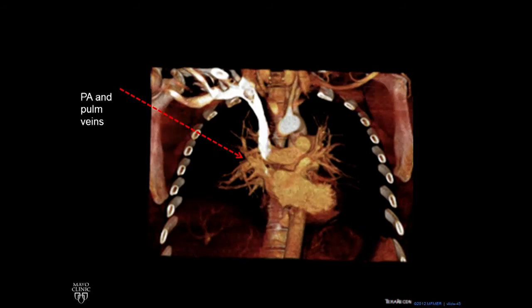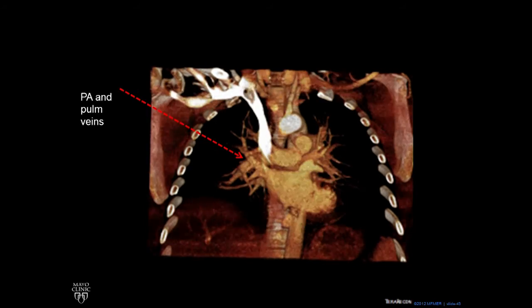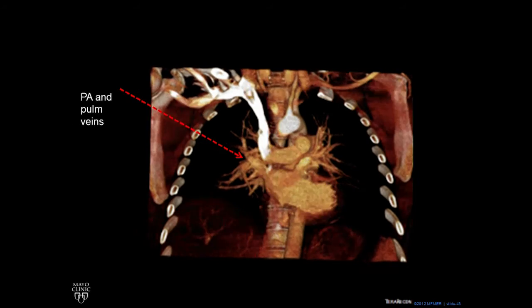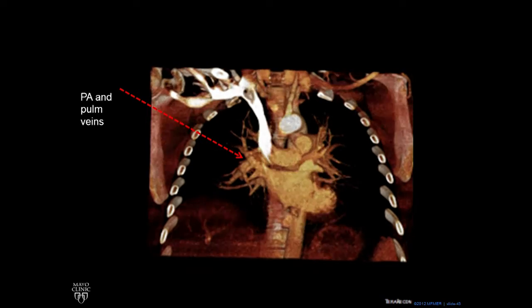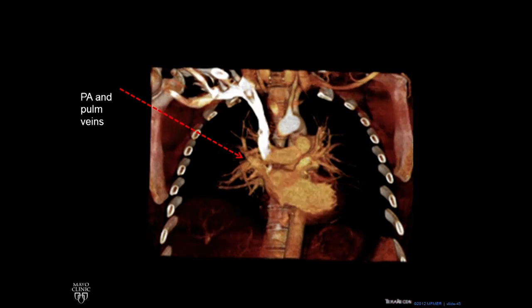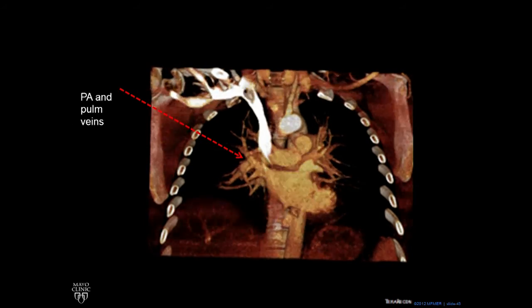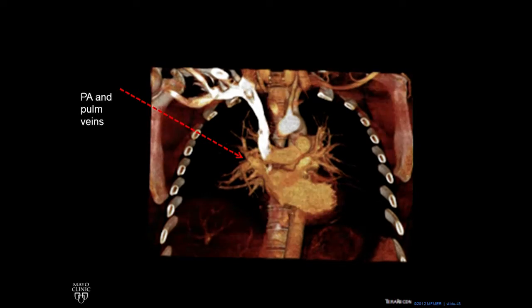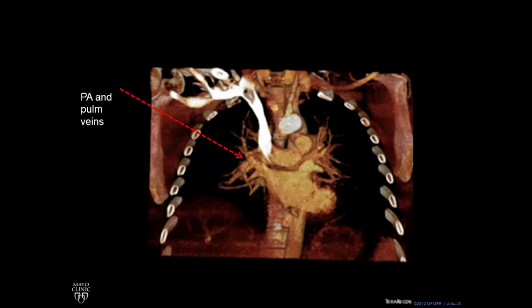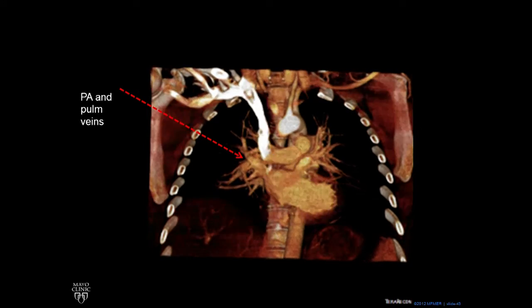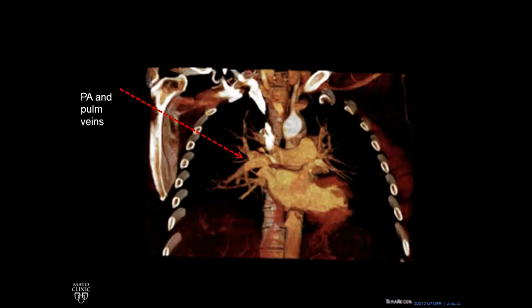Down below the right pulmonary artery, we have the left atrium coming into view, and pulmonary veins. You can see how the pulmonary veins are draining to the left atrium. The pulmonary artery, or the right pulmonary artery, and the veins overlap a little bit.